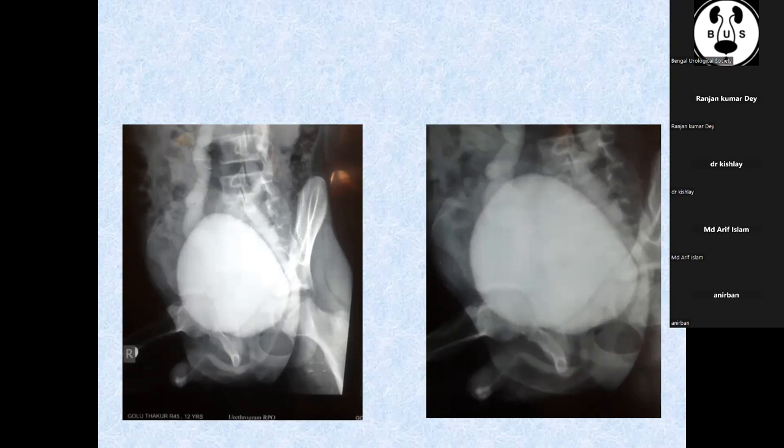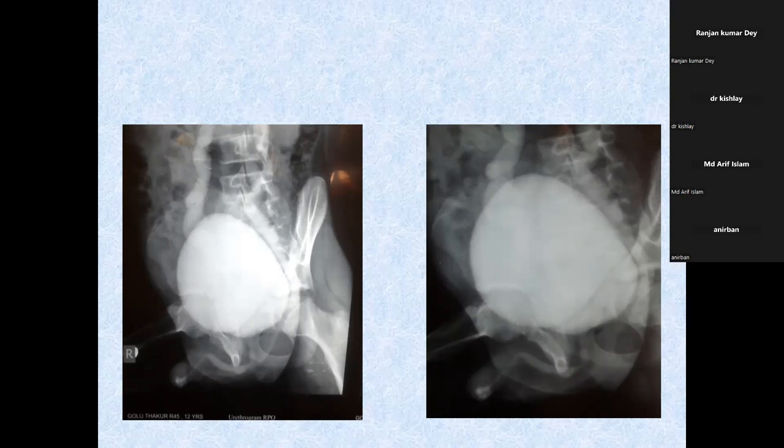Bilateral vesicoureteral reflux. And it can be a neurogenic bladder. Why neurogenic? A distended bladder is usually seen. This is the pre-void film, so it will be distended. Is there any indication of a neurogenic problem from history or physical examination? No. So why, sir, are you going directly to the neurogenic cause? It may be, but common things occur commonly.